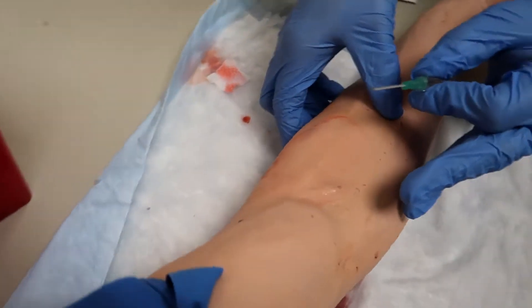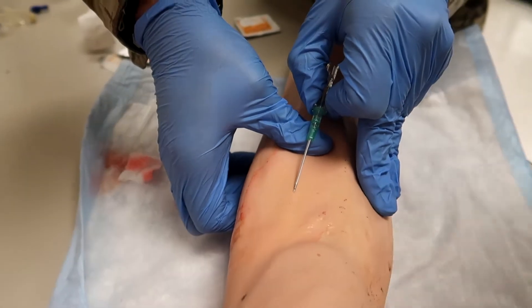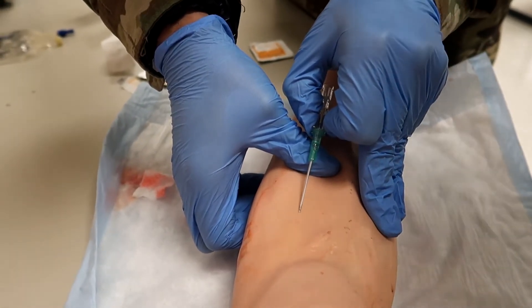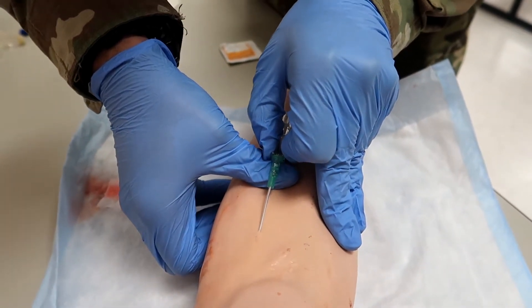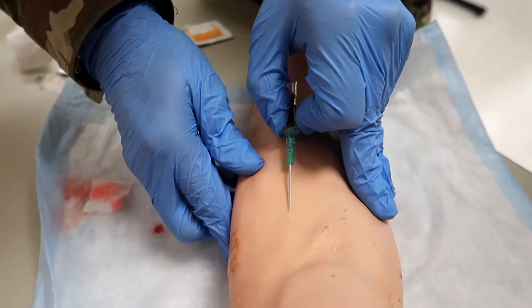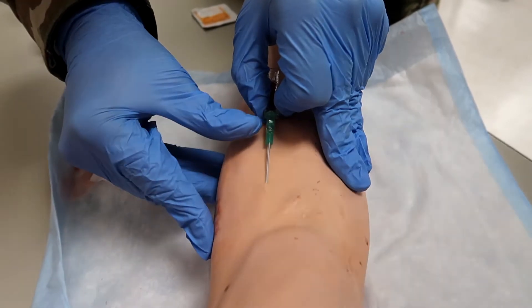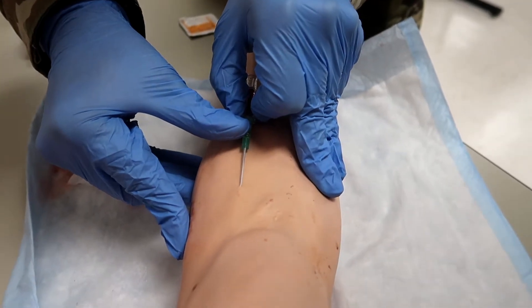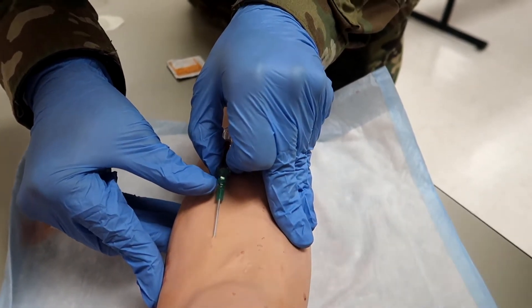He's uncapped his needle — sharps. Now he's going to hold skin taut distal to the site of the venipuncture with his non-dominant hand. He's locating a spot — bam, he's got it. Now he's going to hold the needle at a 20 to 30 degree angle, bevel up over the top of the site, then pierce the skin and advance the needle and catheter until blood is visualized in the chamber. Blood visualized — that is fantastic. He messed up on this a couple days ago when testing out on his skills, but it humbles you and teaches you what to do right the next time.